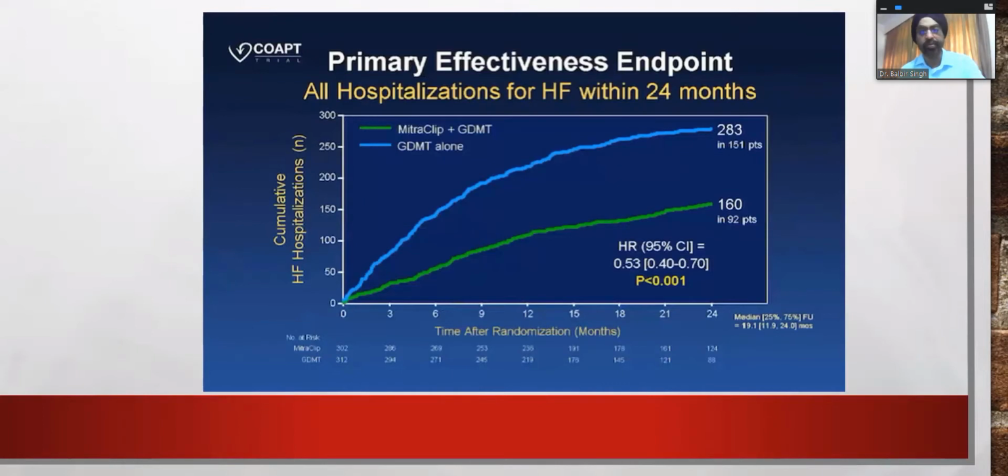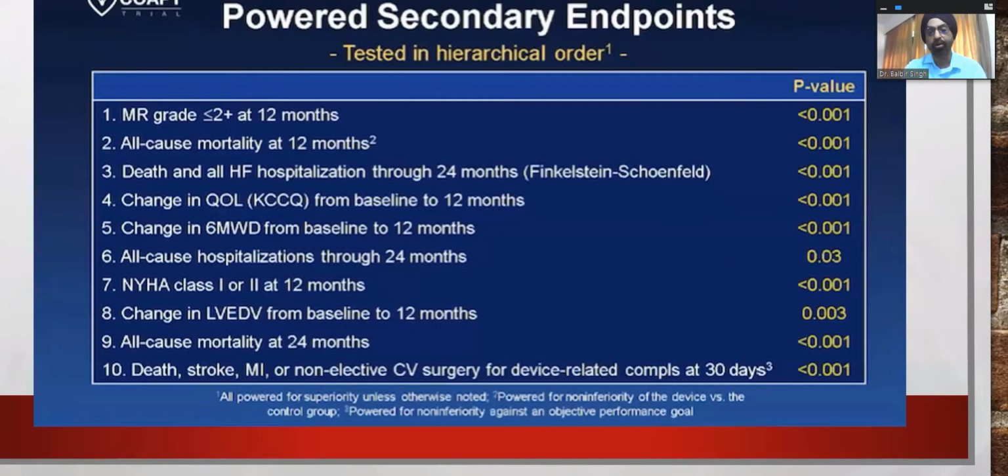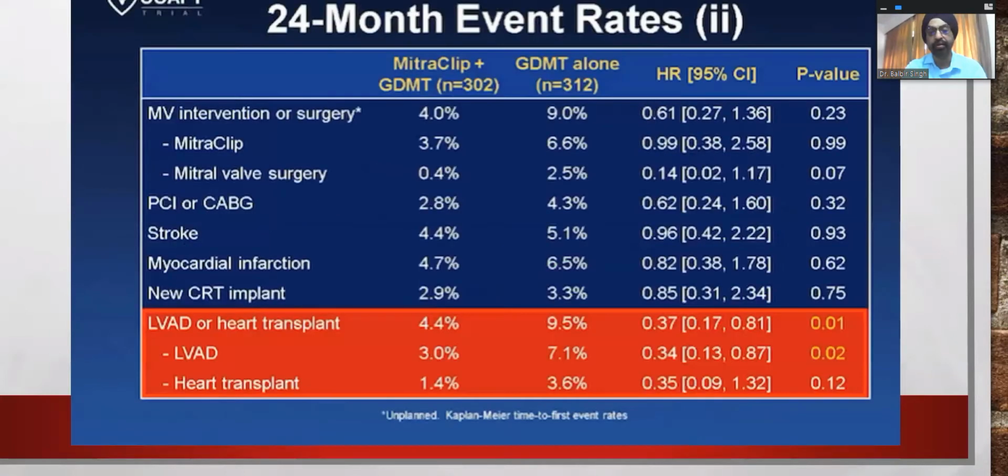So the two patients who have completed 1 month follow-up in our listing are asymptomatic with 1+ MR on echo. Both had 4+ MR. So freedom from device related complication, 96.6%, which makes this procedure very, very safe. So all-cause mortality also was reduced at 24 months, very encouraging results.